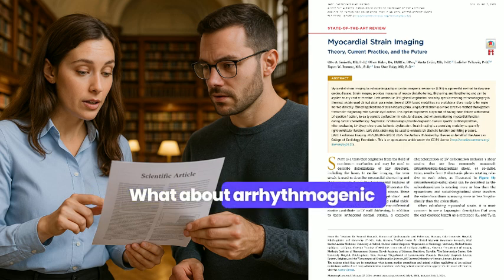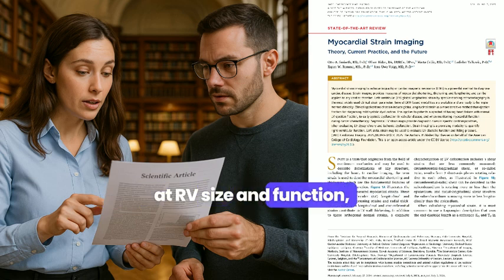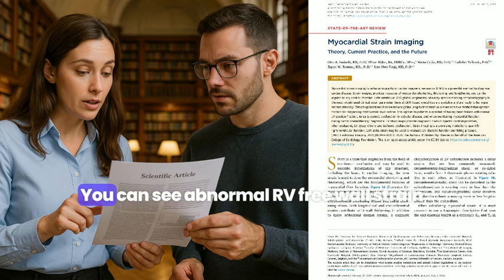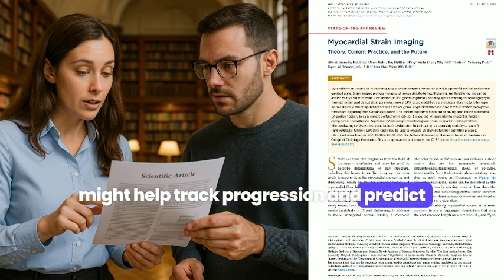What about arrhythmogenic RV cardiomyopathy, ARVC? CMR is still key for diagnosis, looking at RV size and function, but RV strain on echo is emerging as a really promising early marker. You can see abnormal RV free wall strain even in asymptomatic family members with the gene mutation when other echo measures are normal. It might help track progression and predict arrhythmias.